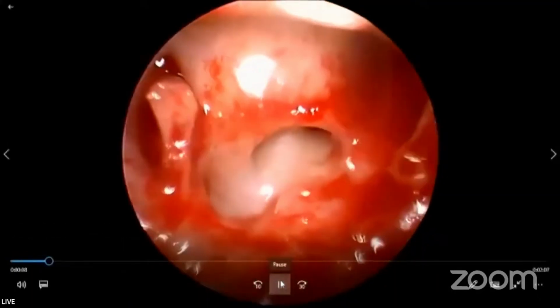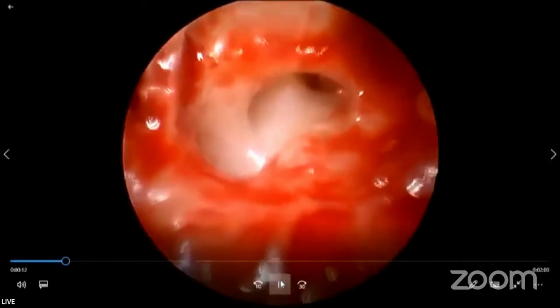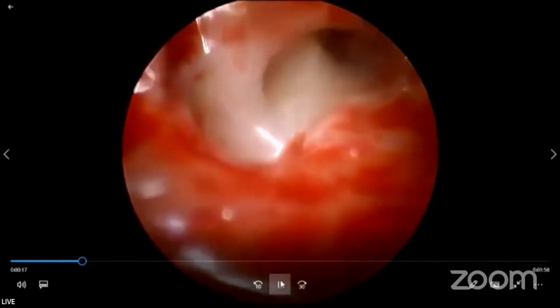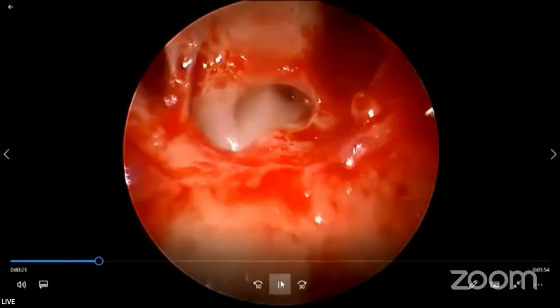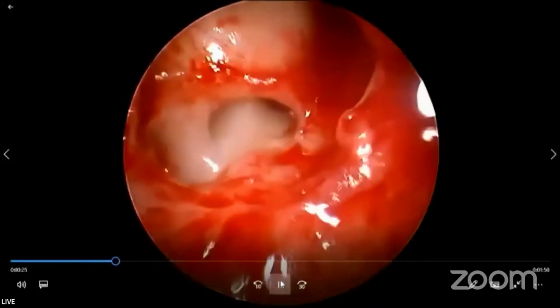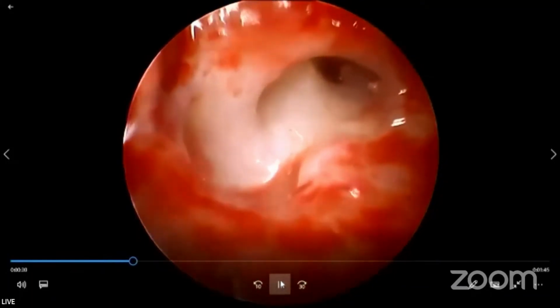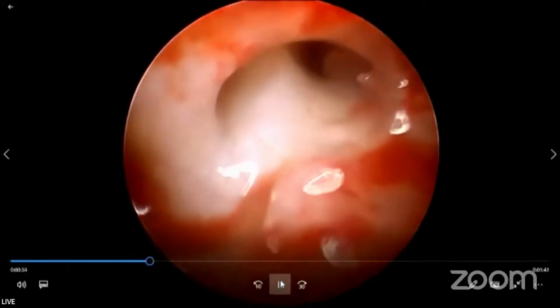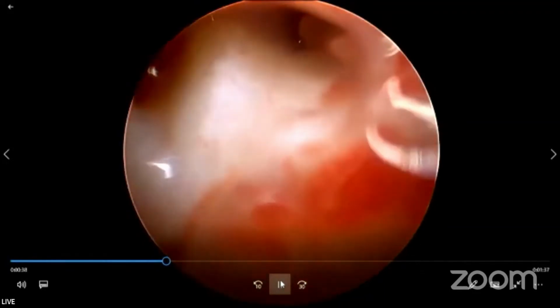So basically the endoscope, this is a 0 degree. This is not an angled endoscope. So very much closer view of the round window, what you can see over there. Just take the endoscope very close to the secondary tympanic membrane. So this picture will never get with the microscope. You cannot go so much nearer without losing the details. So this is into the round window niche.